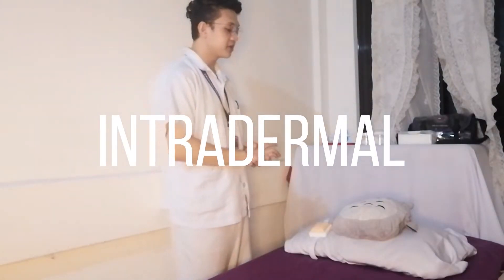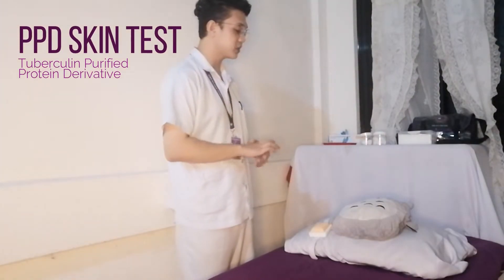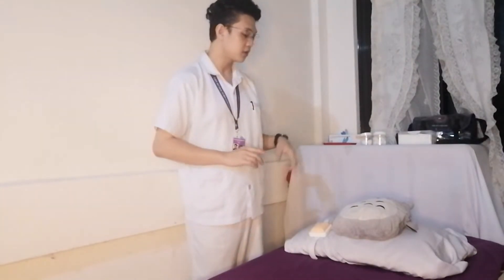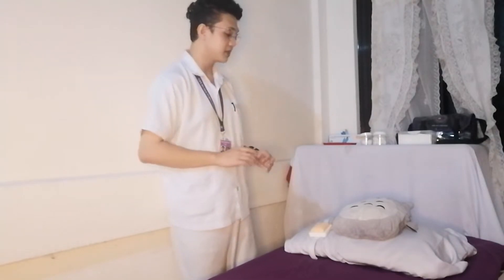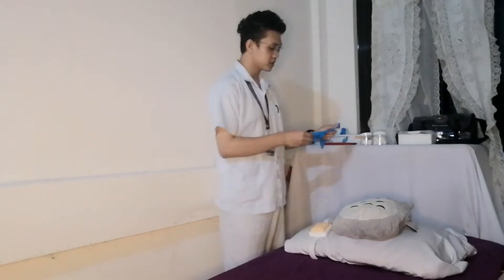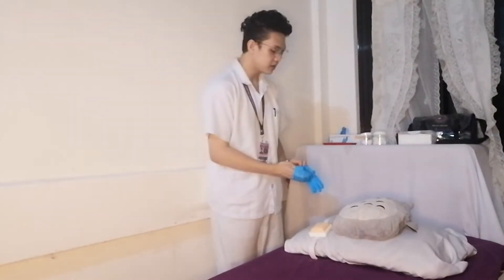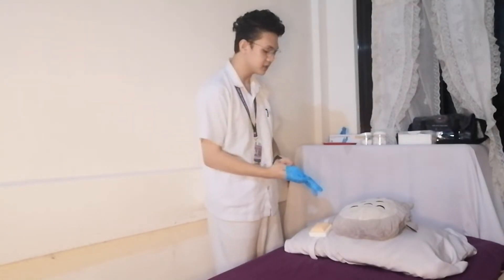Mr. Totoro, the first one will be a tuberculin purified protein derivative or PPD skin test to help diagnose for tuberculosis. This injection will make a small wheal, or what we call a bleb, but you don't have to worry about that — that is completely normal. While I'm prepared, do you have any questions or clarifications? All right, none.